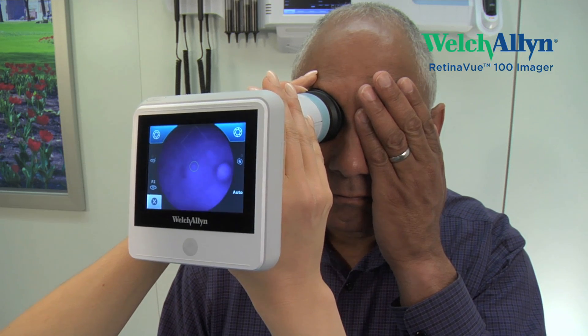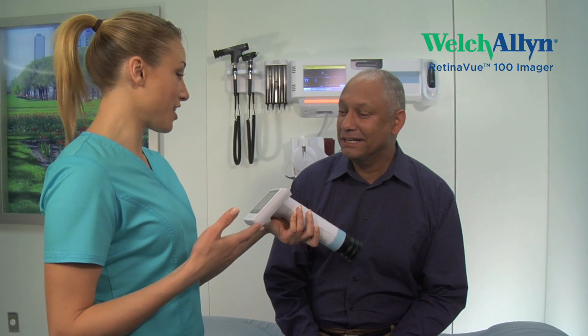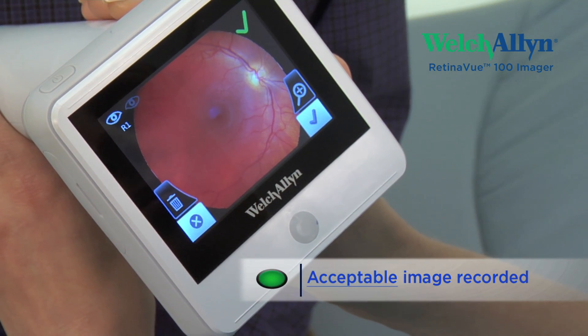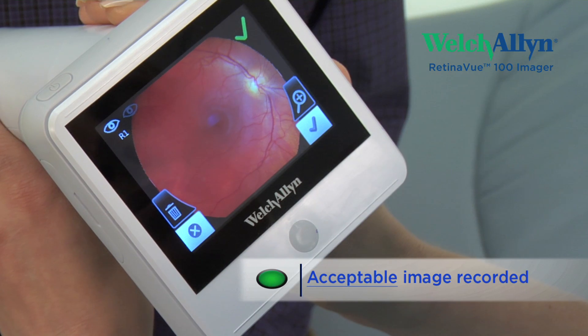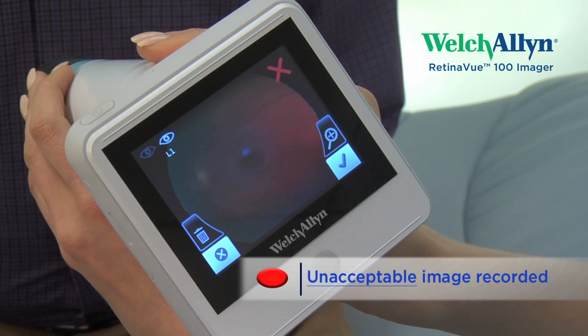They will see a brief flash of light when the RV100 digital image is captured. The RV100 instantly displays an image on the LCD and notifies you if the image meets the quality requirements for specialist review, or if you should acquire a higher-quality image of the eye.